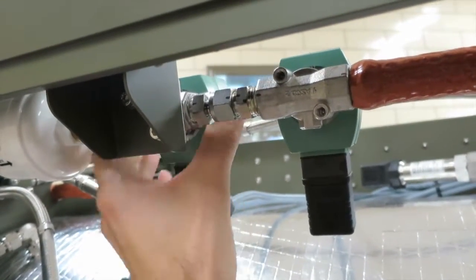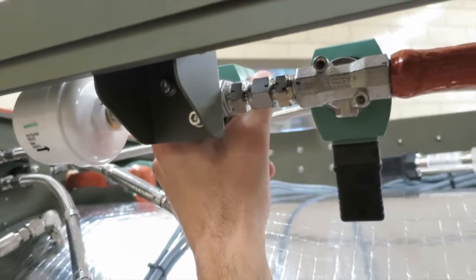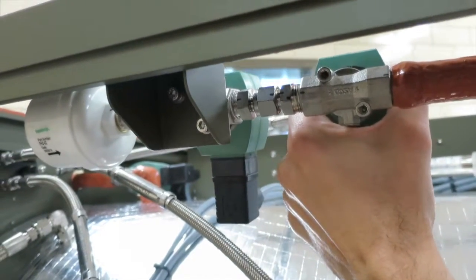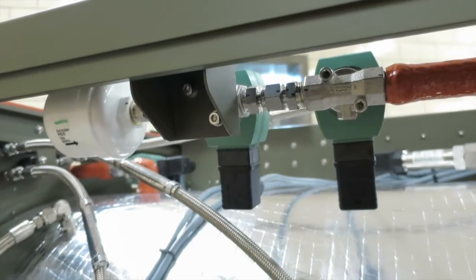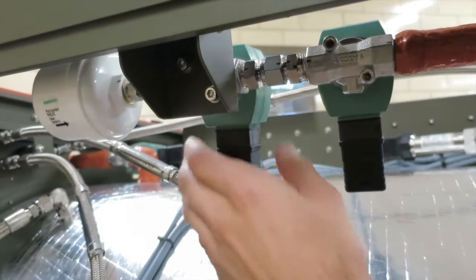The reason we have two is because this one holds vacuum. Whenever there's a vacuum on the chamber, this valve is working. Whenever there's pressure on the chamber, this valve is working. The unit just turned on. We're running a cycle right now, so it'll be a little noisy, but it's just running a cycle as we walk through and talk.